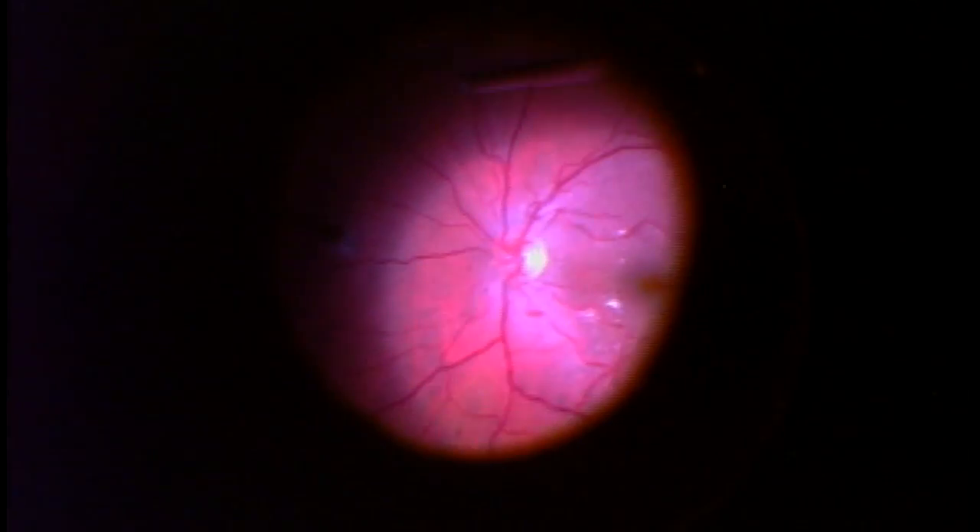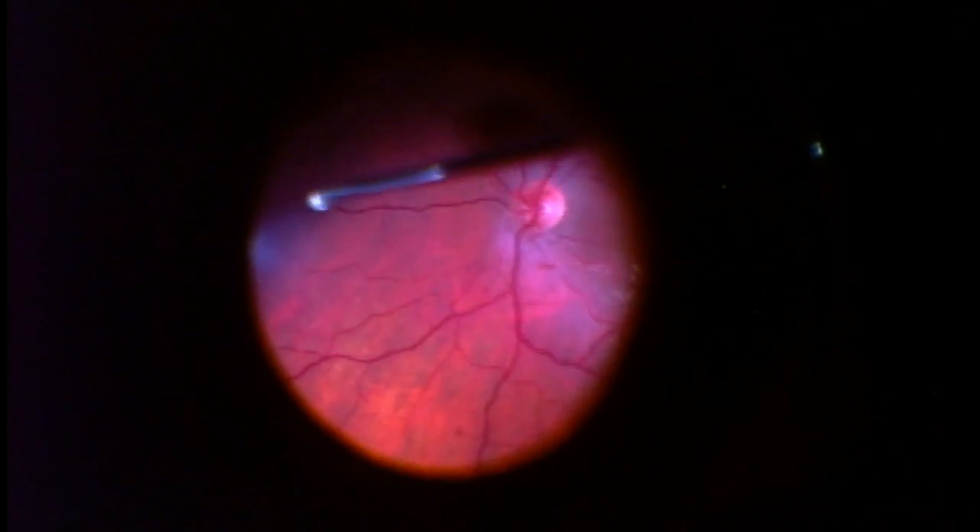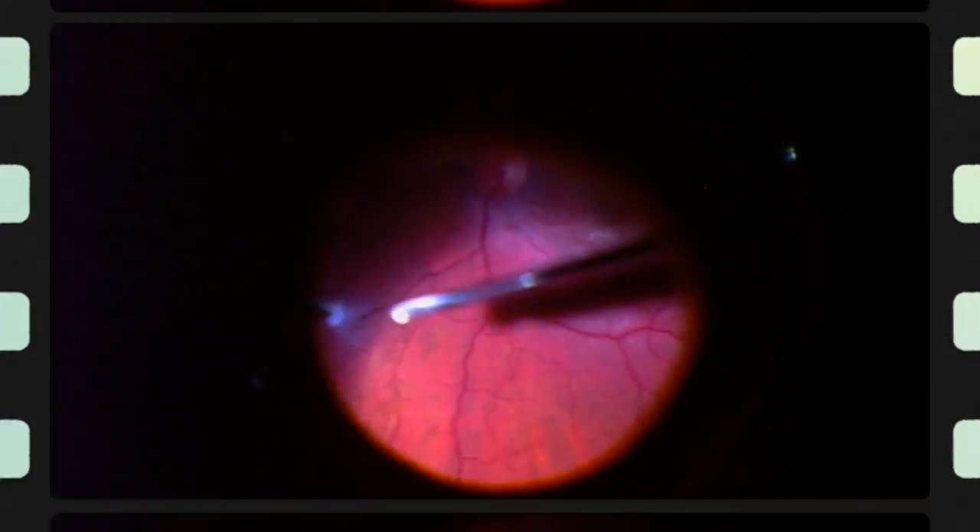What I'm doing here is removing most of the central or core vitreous. At issue is how do I easily remove the thin layer of vitreous that's still stuck to the retina? I do this by injecting Kenalog, which is a steroid, but I use it to basically stain the vitreous.